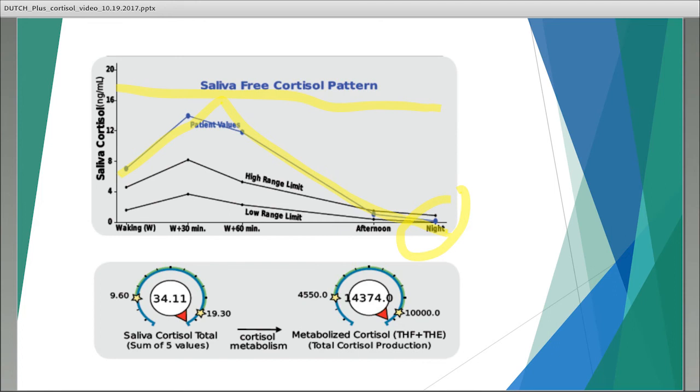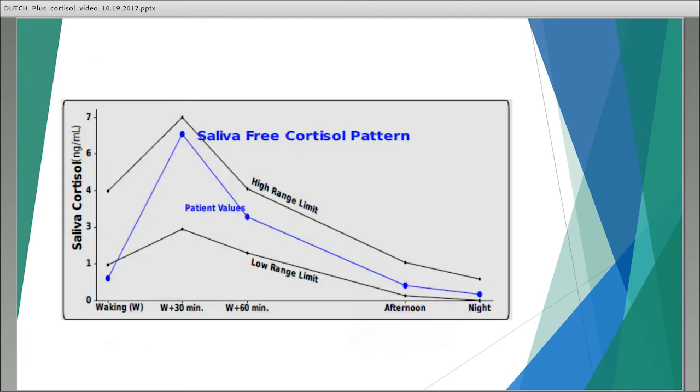So the total of the free cortisol is very, very high. It's particularly high right when they wake up and in that early part of the day. And then we can see from the metabolites, they confirm this story. Yes, there is a lot of cortisol being made and excreted. The actual cortisol awakening response doesn't really add that much to the story, right? If you eliminated this first point, you'd still see that there's a ton of cortisol in the early part of the day. There are a ton of metabolites, right? So the cortisol awakening response, the magnitude of this change is not that abnormal. But you do have, obviously, a very overactive HPA axis.